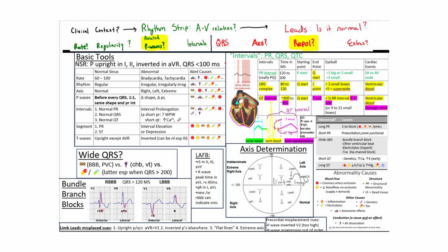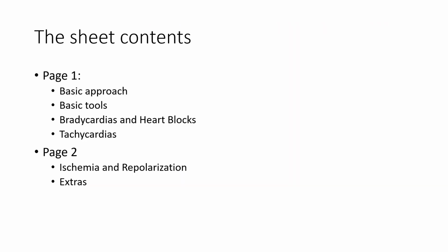Now that we've discussed a way to look at ECGs, here's the information that you'll need to interpret them correctly to answer whether you need to do something right now. I have crammed it onto a 2-sided sheet of paper, and this is the top half of the first page. It contains nearly all the information you need to recognize ischemic, conduction, and electrolyte/toxicologic emergencies, and is organized as above. Based on past feedback requesting summary material, I have attempted to make the ultimate summary.